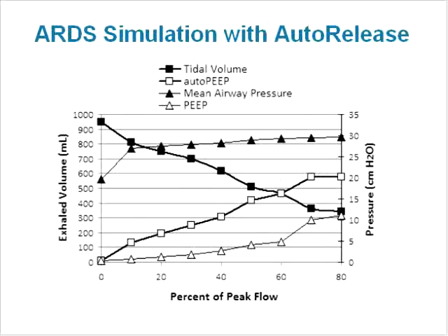These ranges are expected to vary with changes in patient resistance and compliance, further complicating ventilator management. Additionally, inadvertent PEEP at the airway greatly underestimates true auto-PEEP. Nevertheless, the percent peak expiratory flow trigger feature, in other words, auto-release on the Draeger ventilator, seems to provide more precise control during APRV than setting an arbitrary T-low.